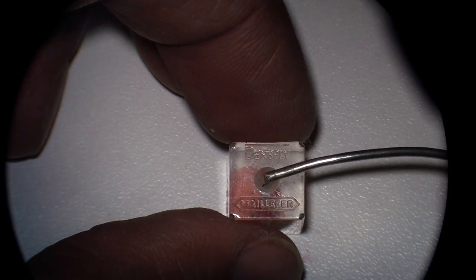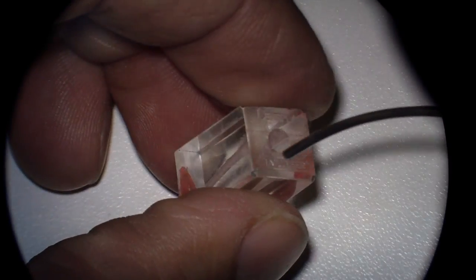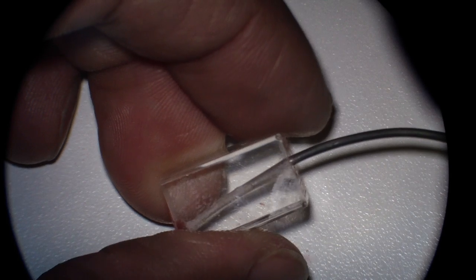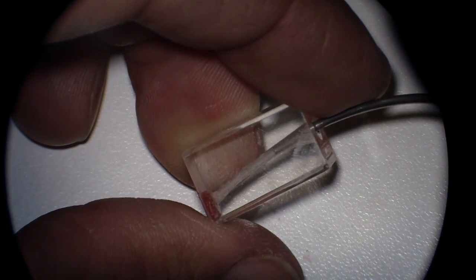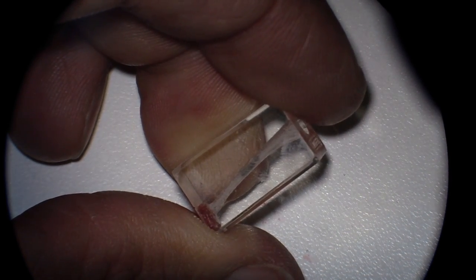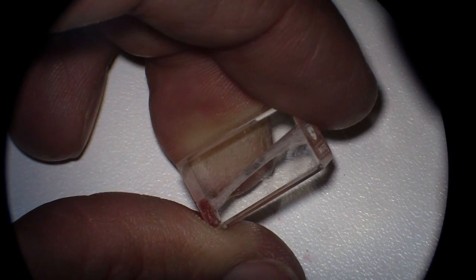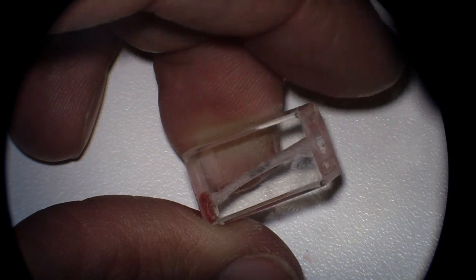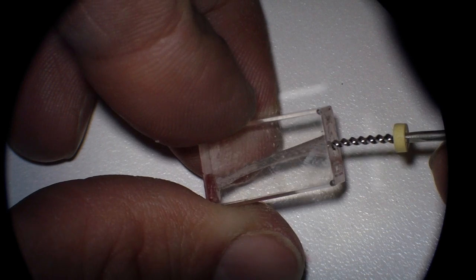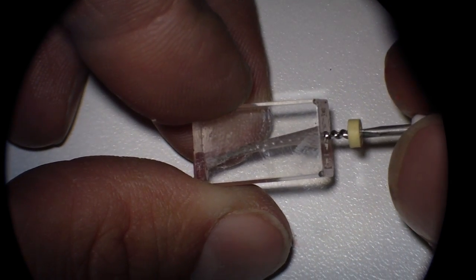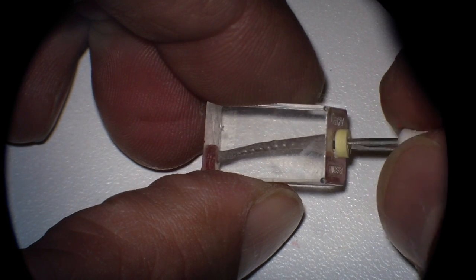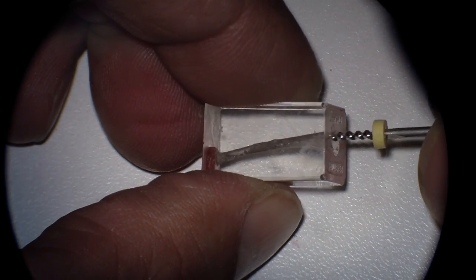Okay, so what I'm going to do is I've taken my MAP, I've filled it with MTA, my MAP system. And we're going to place that in the canal. It looks like that from the coronal, it looks like that from the side view. And we're going to express some MTA into the canal. You can use a smaller carrier, I'm just using this for today's purposes. Now there's two ways you can do it, a number of ways. There's probably a thousand. You can use the file, the master file. Take that to the apical portion, sort of spin it down. That's what Dr. Crossfit has taught me.